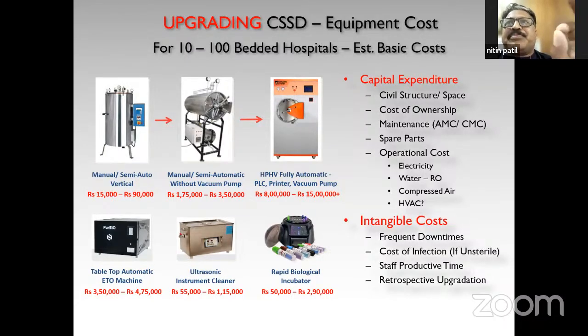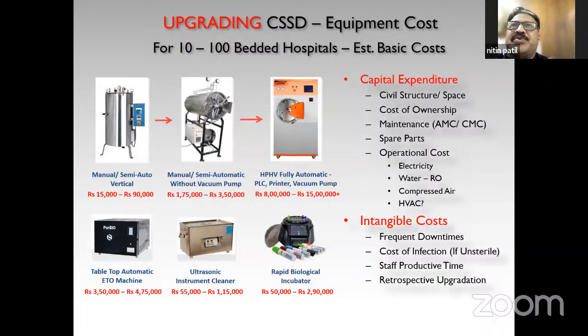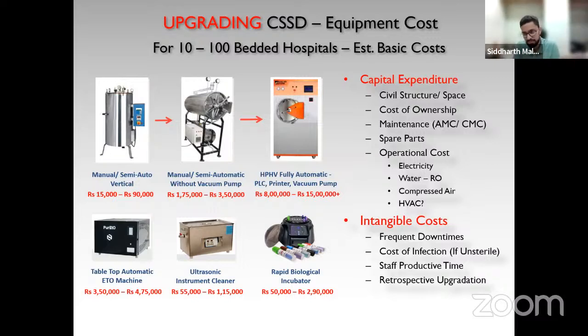It is the pressure per square inch, which is usually, I think, 15 pounds per square inch. Right, yes, sir. And after the pressure is reached, we keep that specific pressure for 15 to 20 minutes, and when that time is over, the inside markers are turned for good. Right. Okay. This is one.